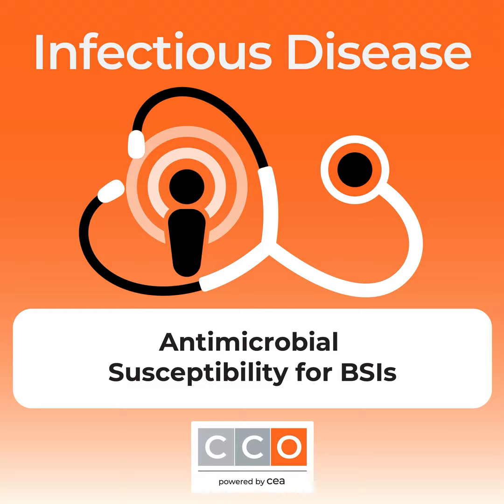Having this in perspective is critical to know how this technology, the BCID and rapid AST, is going to fit into the equation to provide the patient with a proper escalation or de-escalation of treatment.